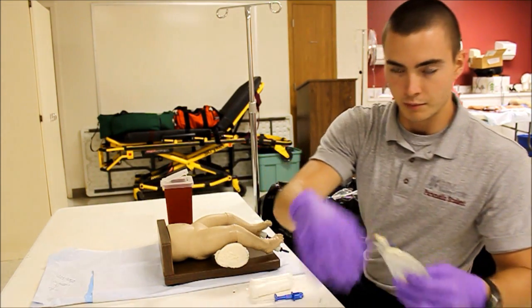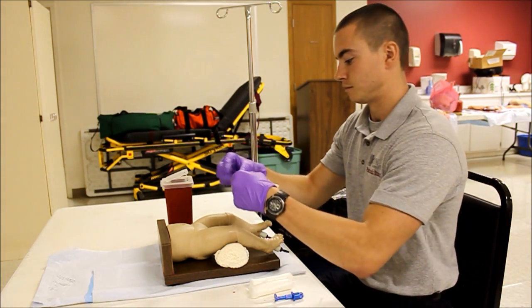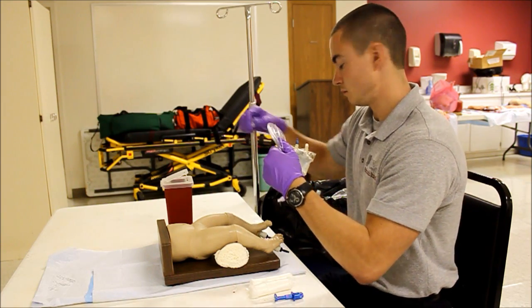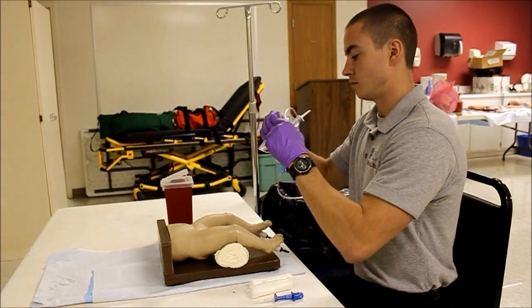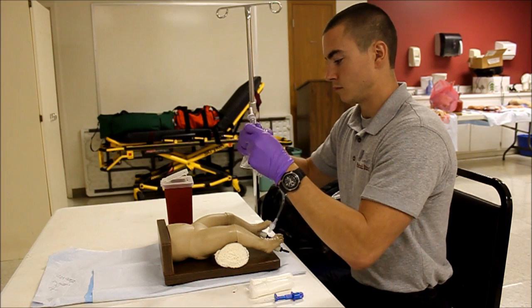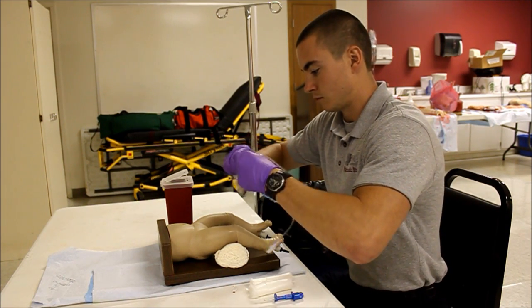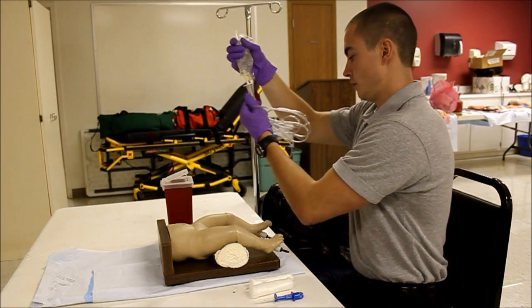At this point I'm going to go ahead and prepare my administration set. I'm going to go ahead and pre-fill my drip chamber.